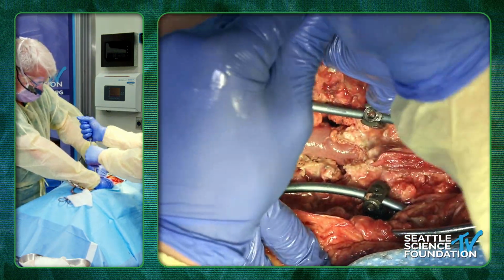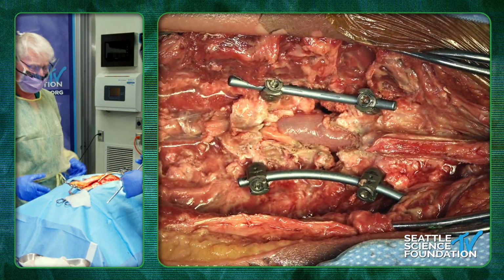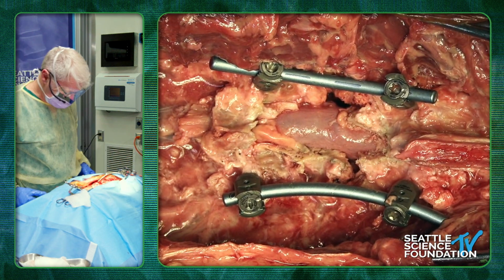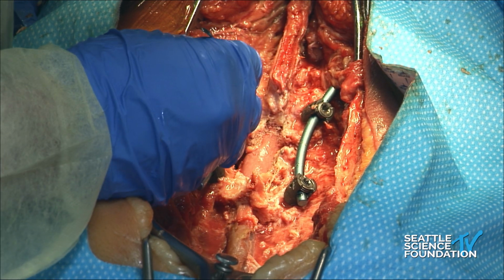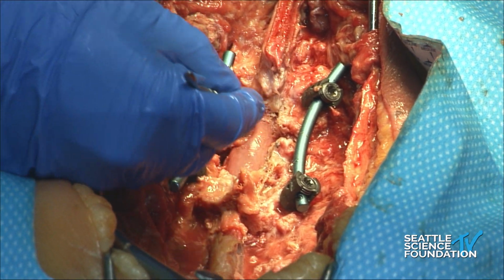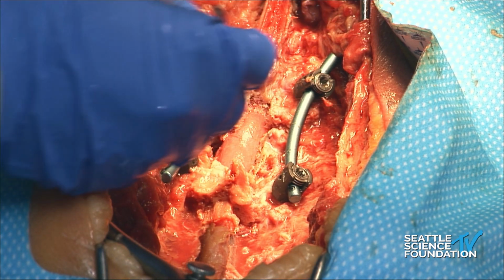Okay, perfect. So what we've done, with a proper instrument, we'll squeeze that down more, and you can see that you can get your offset correction like this. Can you compress that whole side, the gap side, a little bit more? Because one thing that always troubled me about my PSOs is, I decompressed a whole level above and below the PSO level to not have dural, and I'd always get dural infolding, or I'd get what you're seeing here, this kind of guillotining or this choking in on the adjacent segment.